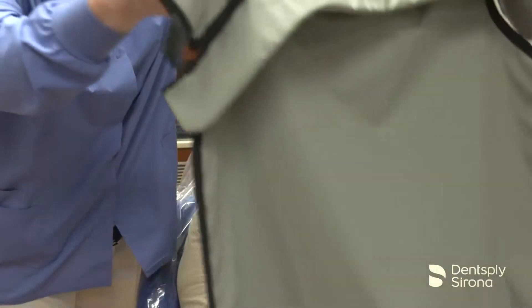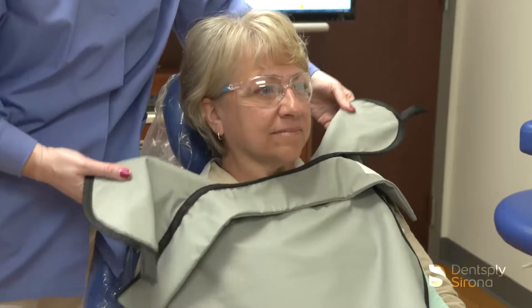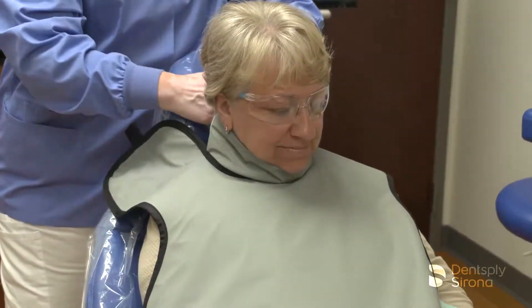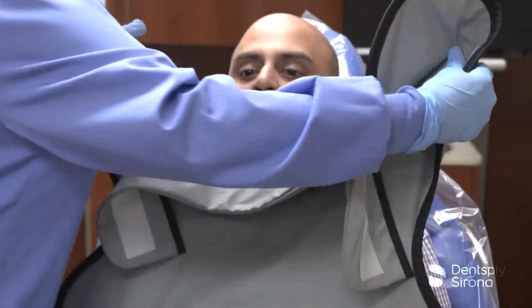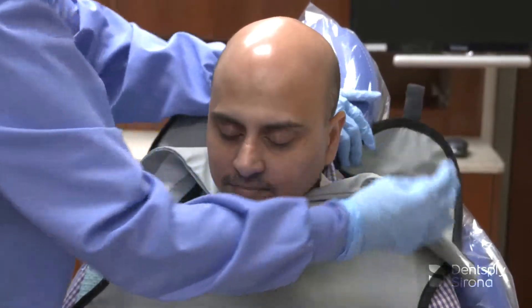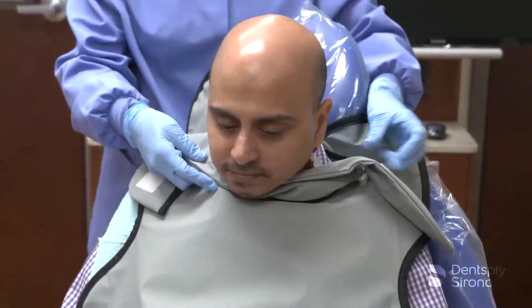Protective aprons have been utilized in dentistry to minimize scatter radiation to patients. Various designs and materials have been utilized in dental aprons by different manufacturers, all providing protection to the patient while giving some added benefit to the clinician, such as ease of care or lighter weight materials like those found in RIN's SootheGuard Air Apron.